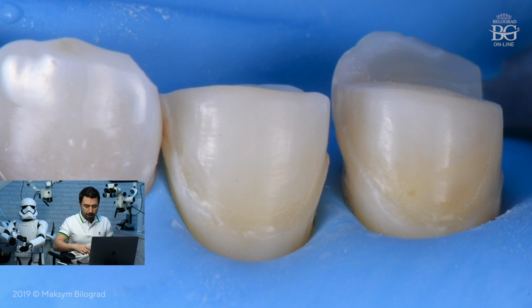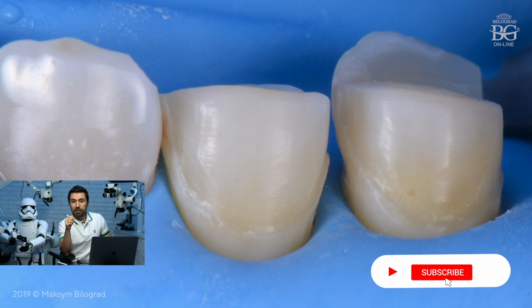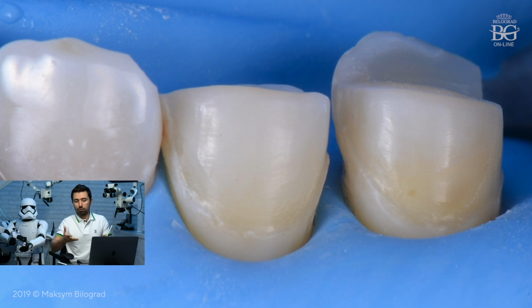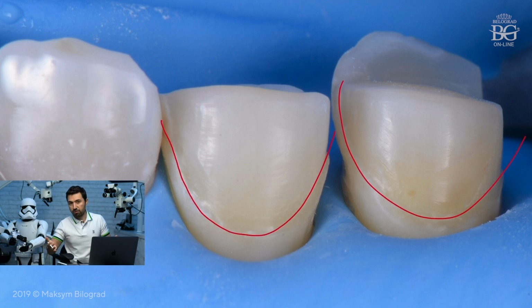Okay, and when we were bonding our ceramic restorations, what was also interesting, we didn't need to do an aggressive isolation with the clamps or whatever, because all our finish lines are supragingival, and we can just do normal isolation, as you can see here on that slide, and every single margin is already exposed, and we can just bond our ceramic restoration with no time spent doing aggressive isolation.